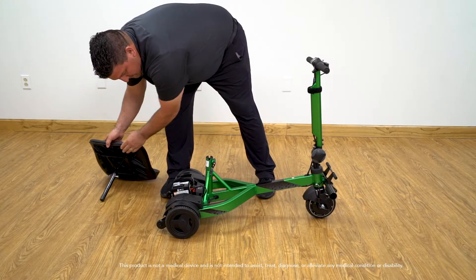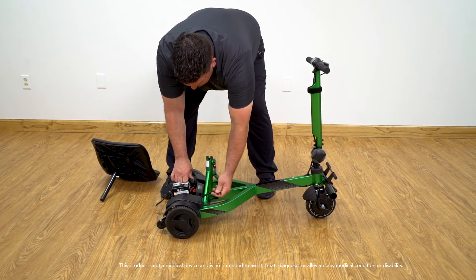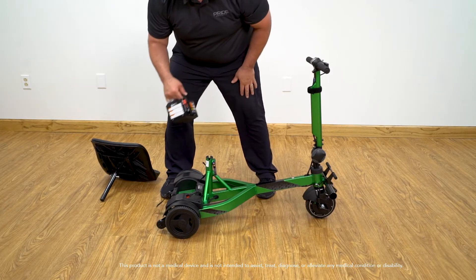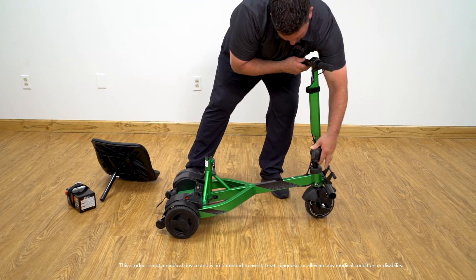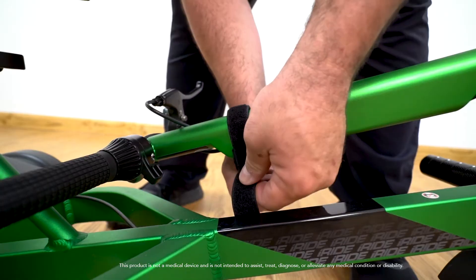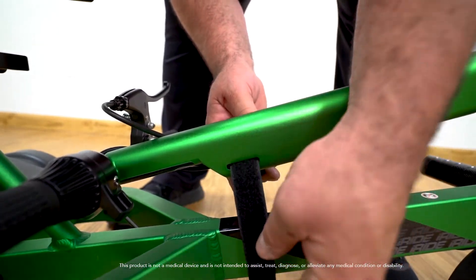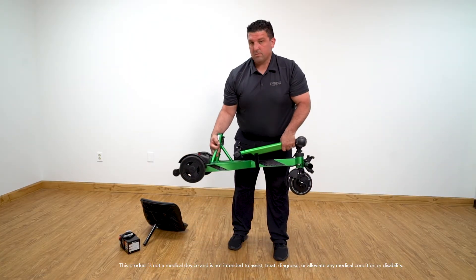Remove the seat, which is optional. Remove the battery connector from the battery. Remember to shut off the power switch on the battery after every use. Then lower the tiller and lock into place. Use the strap on the tiller to secure it to the frame — this will prevent the tiller from moving. You are now ready to transport the iRide.